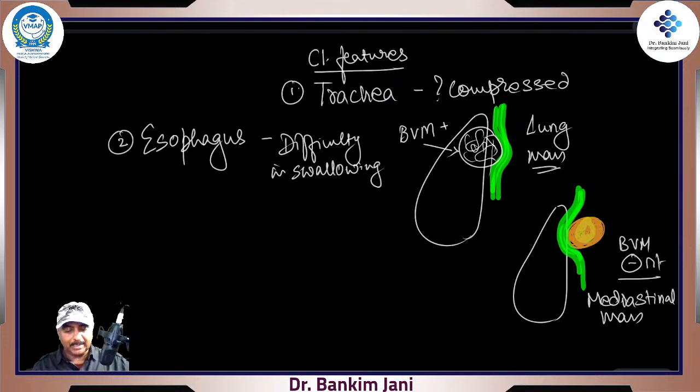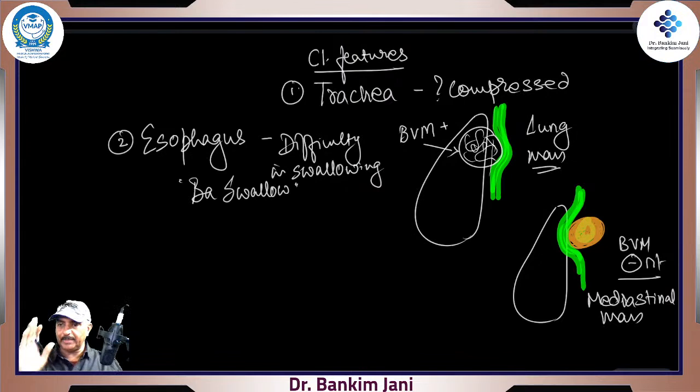And sometimes you have to go for what's called the barium swallow. When you see the barium swallow, you'll be able to see the compression on the esophagus, right?